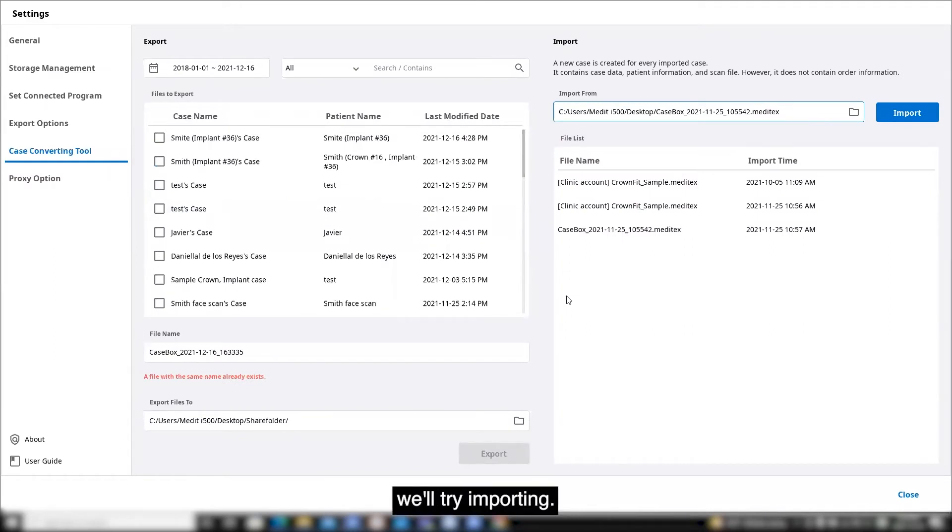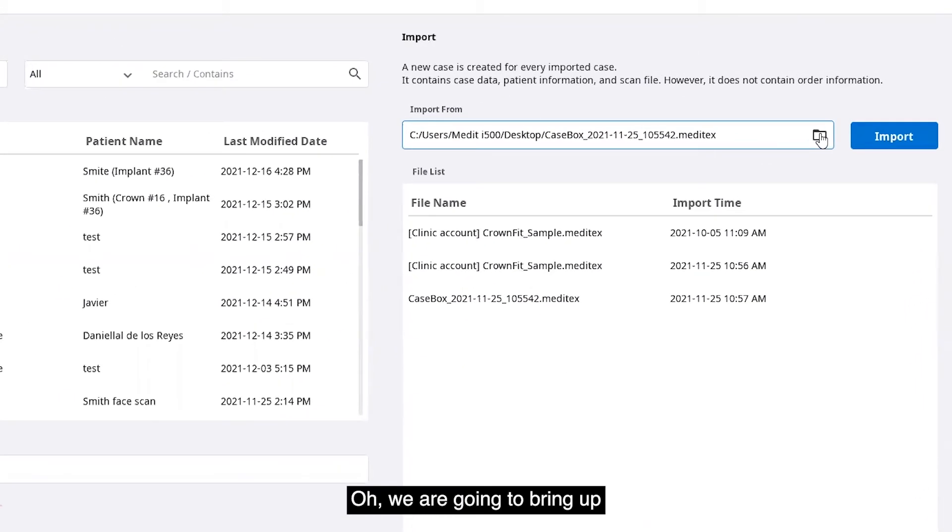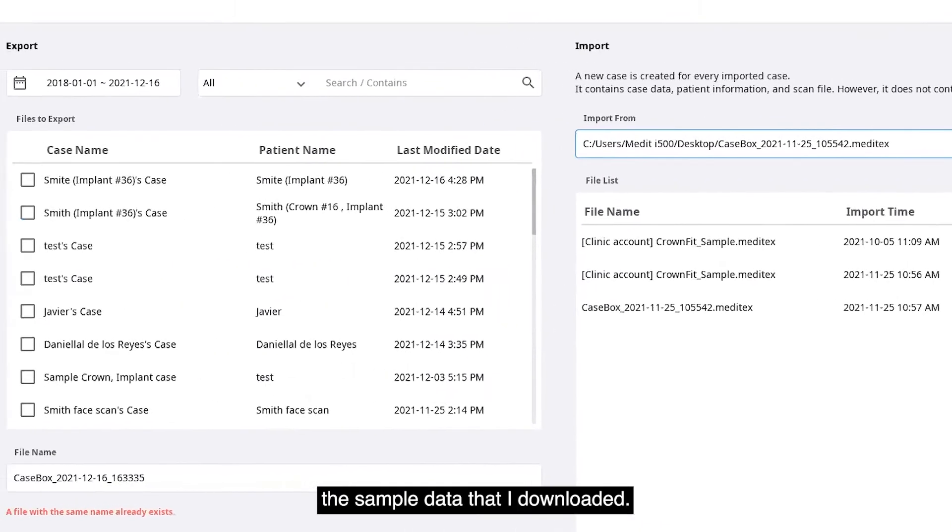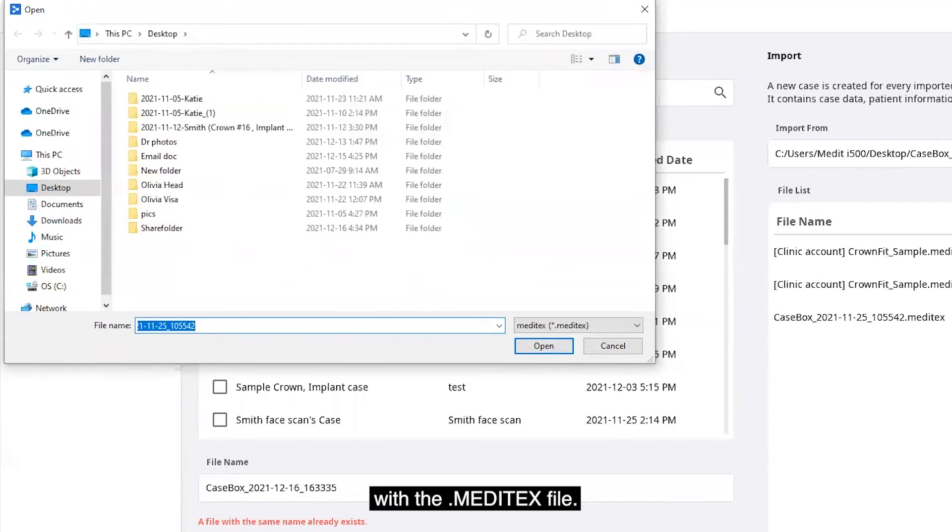Next, we'll try importing. We are going to bring up the sample data that I downloaded. Click the folder icon and choose a path with the .meditex file.